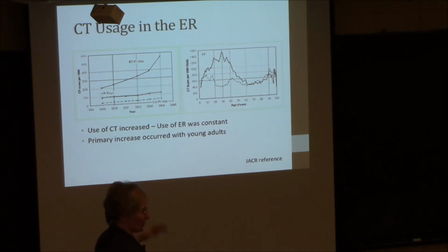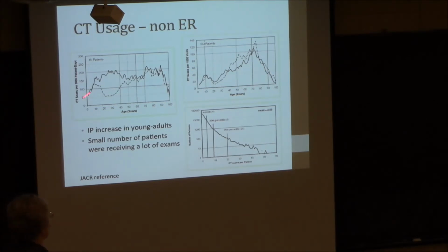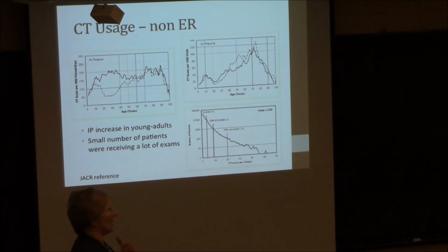And so those were two huge areas of concern in the ER. And then in fact, for hospital inpatients, the same thing happened. The reason for this is that if you go into the hospital and you've had a stroke or some kind of emergent condition, they want to follow you. So we'll have people that get a CT a day for 2 weeks. And this radiation dose is obviously significant. Outpatient didn't change a whole lot. If you go in once and have one and they say you're fine and you go home, it didn't really seem to matter, but it was the inpatients and the ER patients.